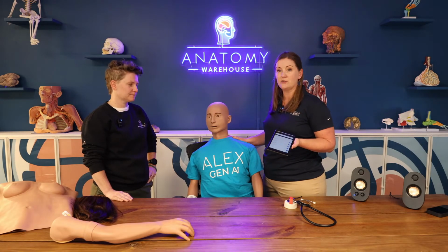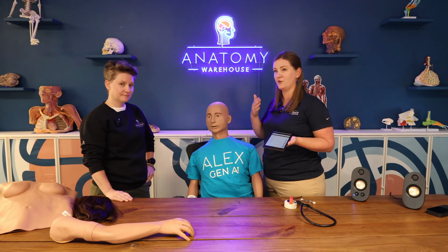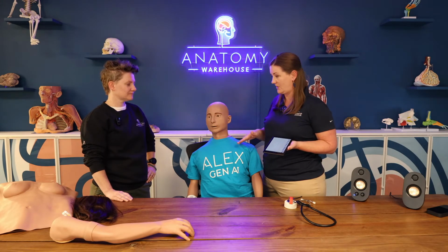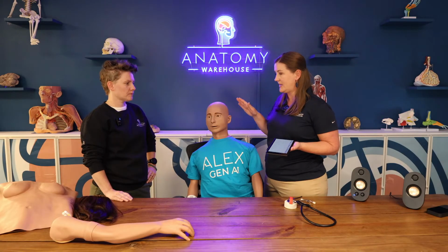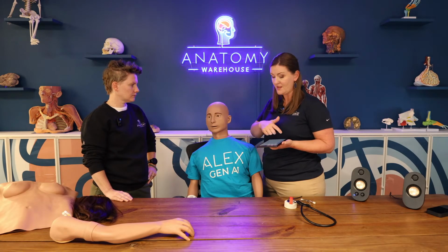Yeah. So instructors are perpetually asking for feedback and data, and they need to show their students over the course of a period of time. The Simulation Log Archive captures all of that. So it captures all the interactions, captures the iris camera that they can record if they so choose, captures any of the physical data that the student has done in conjunction with the mannequin, and they can open it and review it.